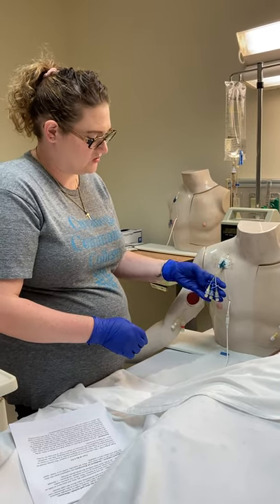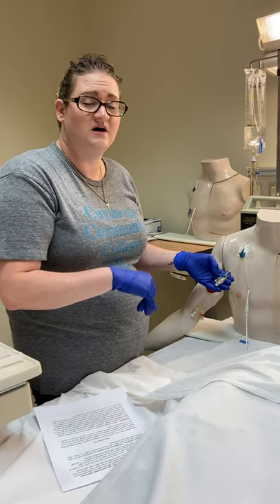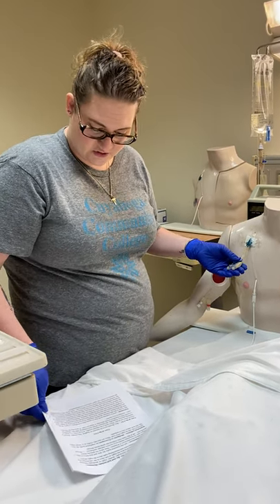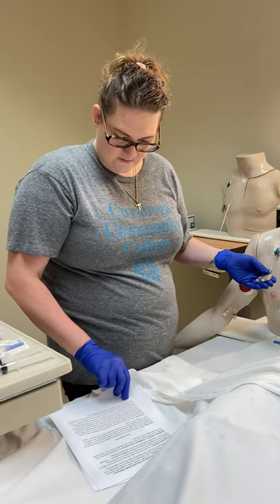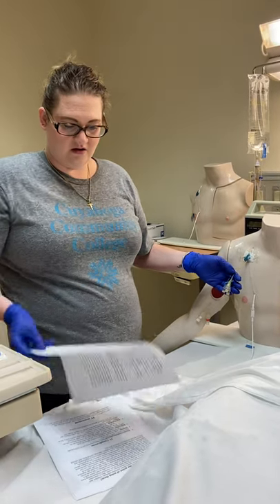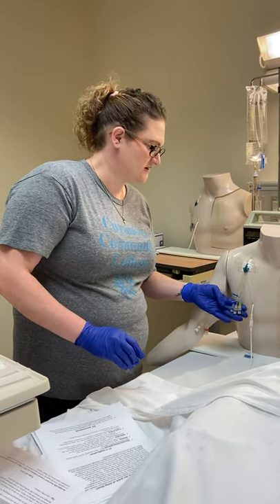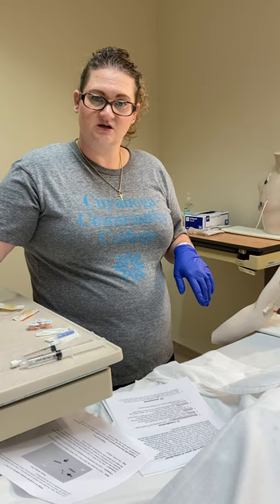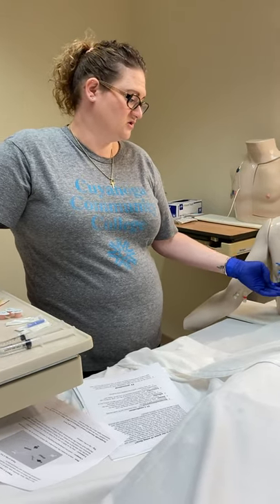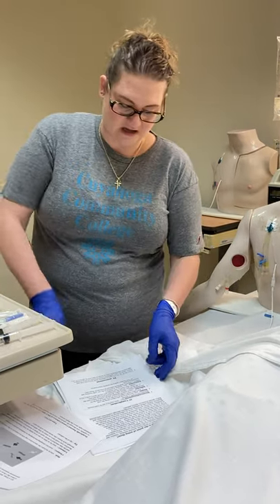Central line infection is a big concern. Just like with the peripheral IV, doing a full 15-second scrub with your alcohol swabs is very, very important here — don't short that. We also want to make sure there are no knots, kinks, or tangles in your lines, which could signify integrity issues. Dressings are usually good for about seven days, but check your facility policy. When we change the dressing, we would also typically change the caps if they hadn't been changed already.